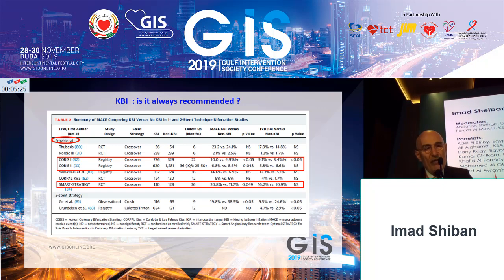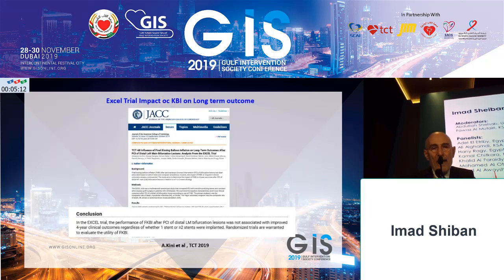This is true for provisional stenting, but it's not true for two-stent techniques. You see that kissing balloon inflation in two-stent technique strategies is doing much better than without kissing balloon inflation.